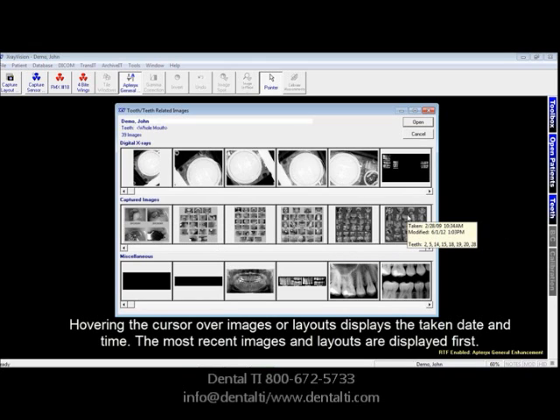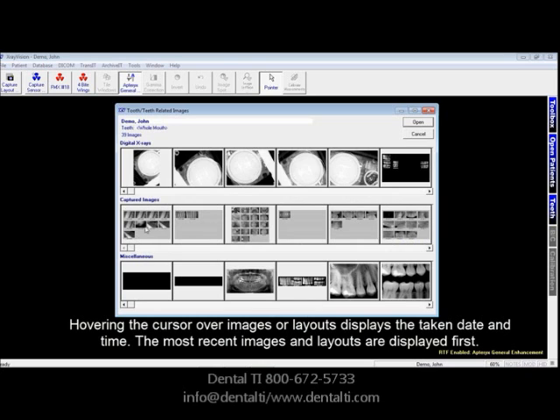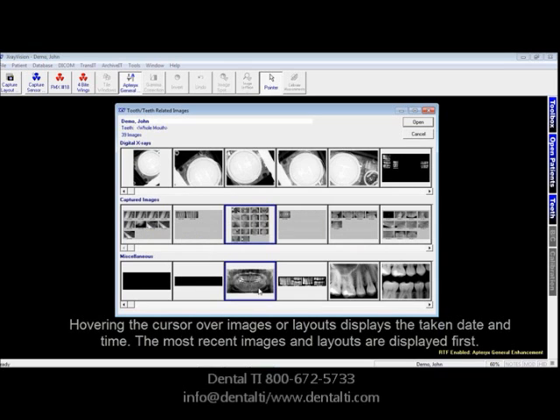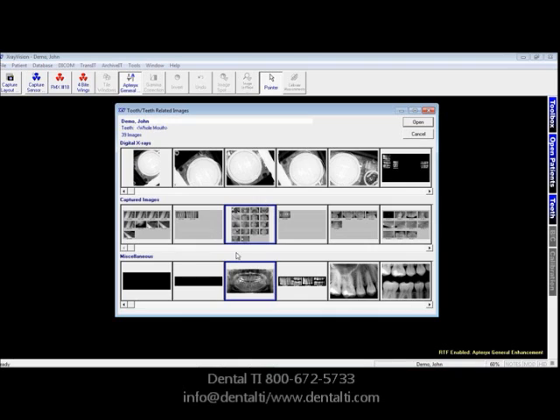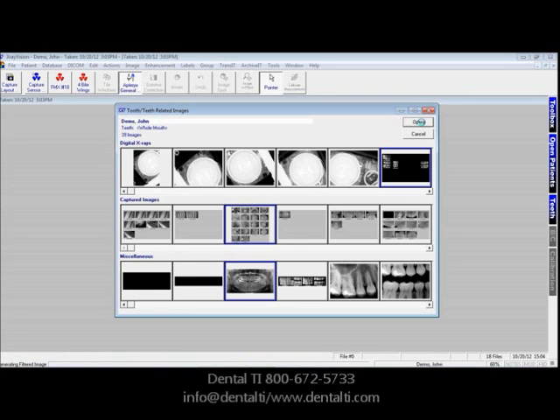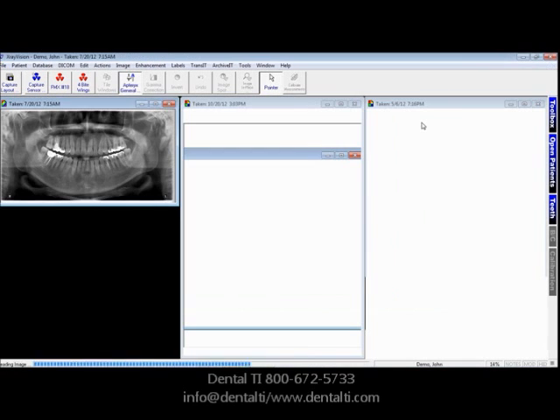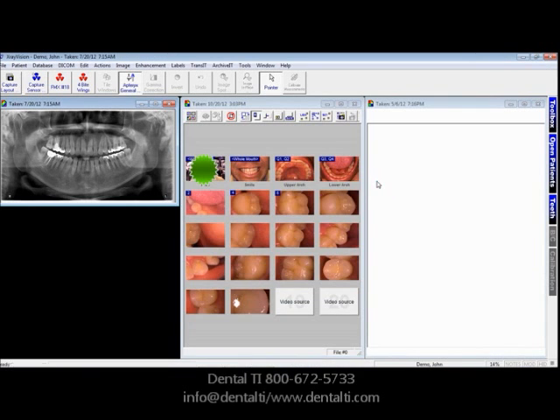This image was taken on 2-28-09, and the most recent was taken on 10-20-2012. Just as when we select individual images, we can select by highlighting or clicking the image — it will be highlighted in blue — for the images that we want to open, and then they are opened on the desktop.